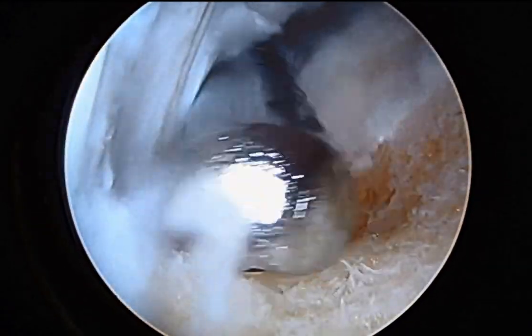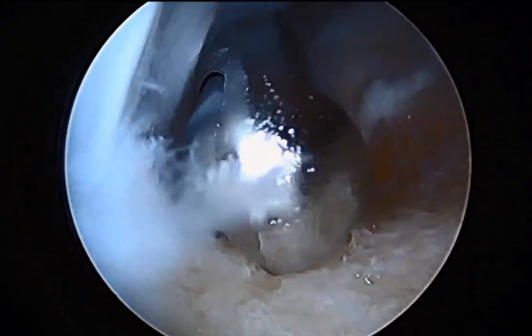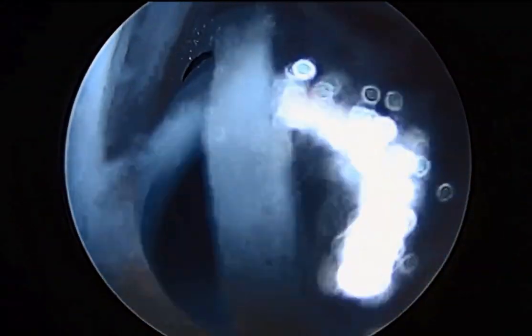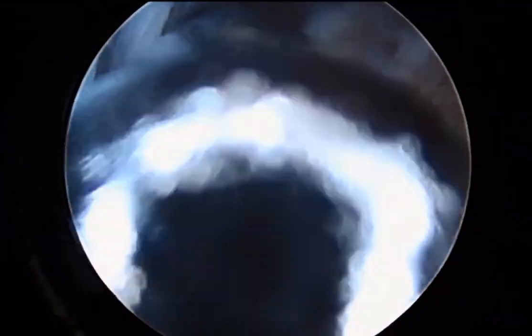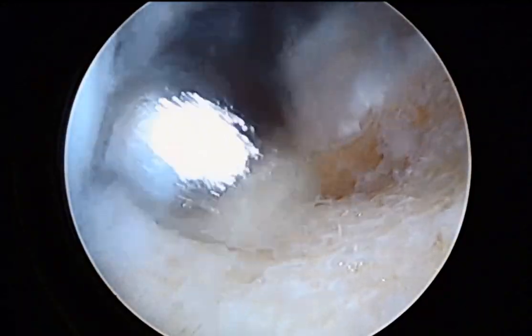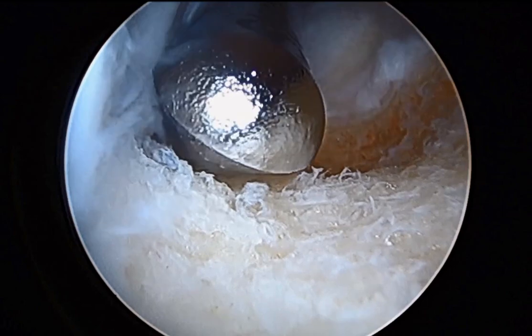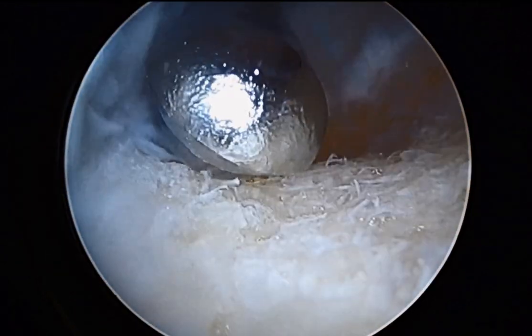This is a short segment of an arthroscopic or endoscopic calcaneoplasty for pain in the back of the heel. This is a minimally invasive surgical procedure with two small 6 to 8 millimeter incisions at the back of the heel, done to decompress and remove a painful prominence in the back of the heel.